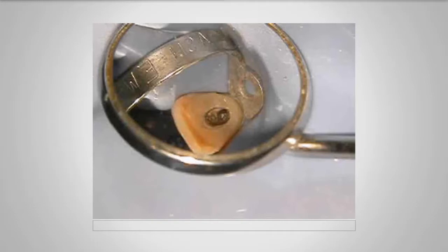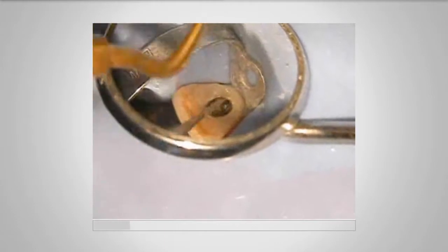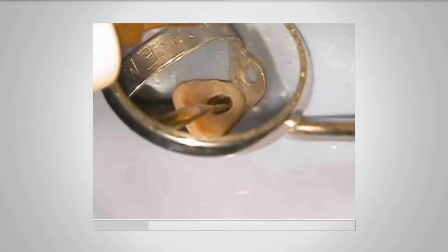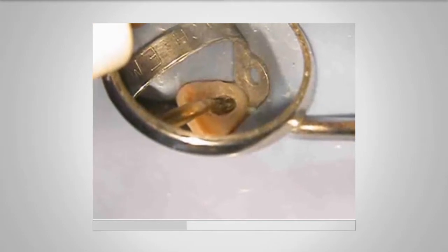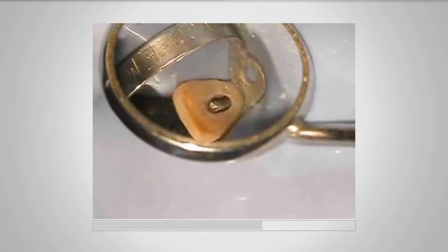So I'm coming in here with my fine ultrasonic tip, and I'm going to touch that on the side of the separated file, and you'll see that after a while it loosens, and then starts to unscrew, coming right up into the access, and now I can retrieve that very simply.